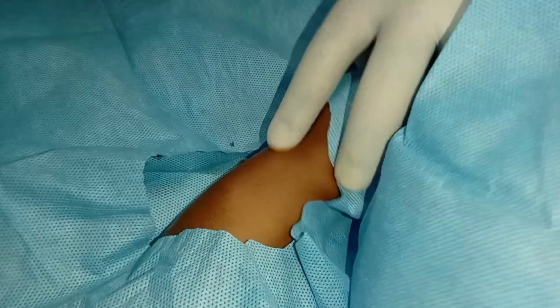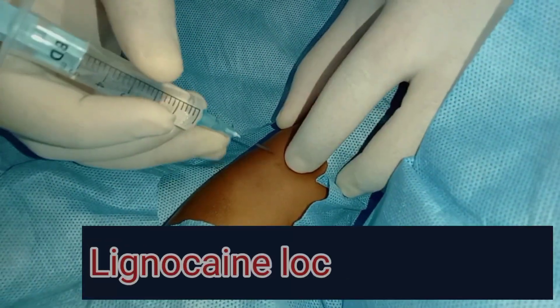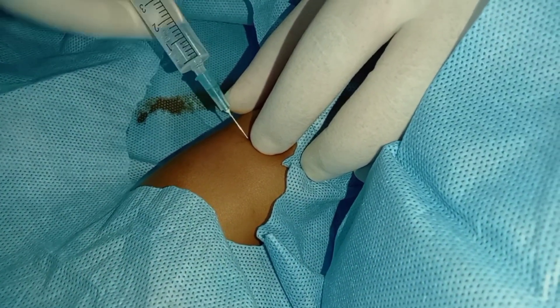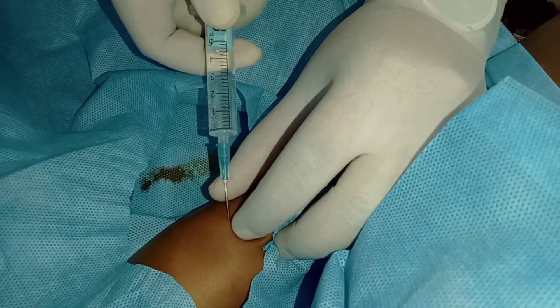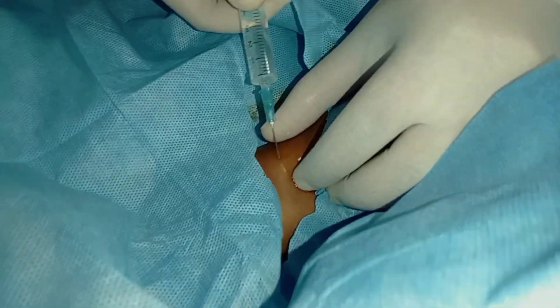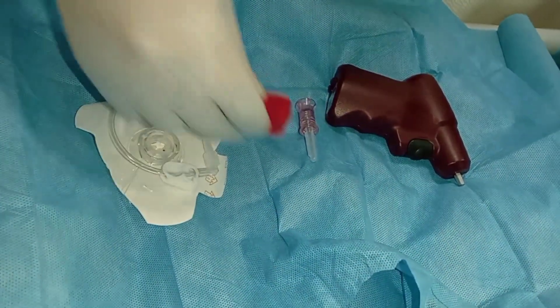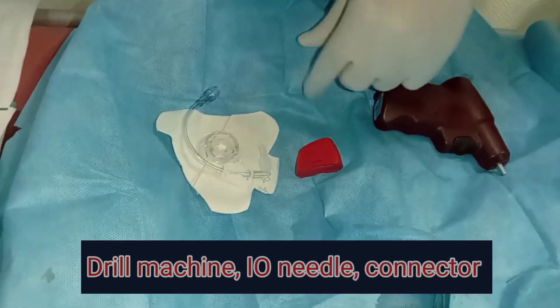After a short cleaning and draping, lignocaine may be infiltrated into and around the periosteum of that area. The periosteum is a sensitive tissue, and infiltration of lignocaine around this site will decrease the pain as far as possible. However, pain is not of much importance here as it is a life-saving procedure.